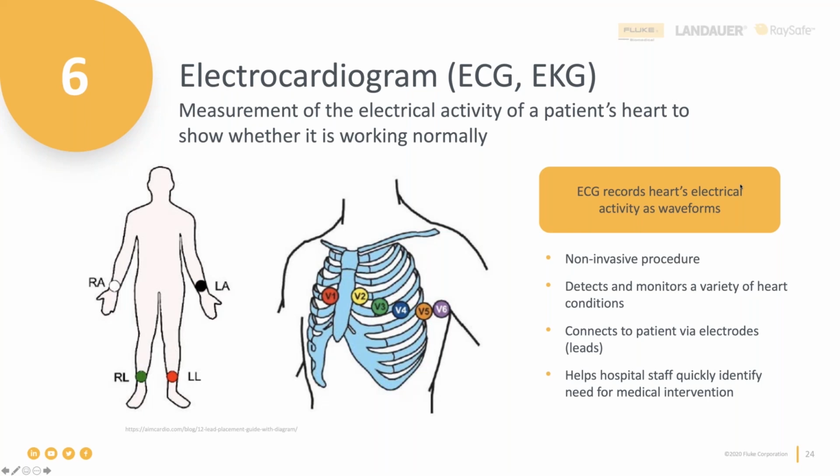I wanted to show why it is called a 12 lead placement, but basically it enables seeing the heart of the patient from 12 different angles, because some of the limb electrodes, for example, right arm and left leg, or left leg and left arm, form pairs, and those pairs can look at the heart from additional angles, and right leg is just ground.